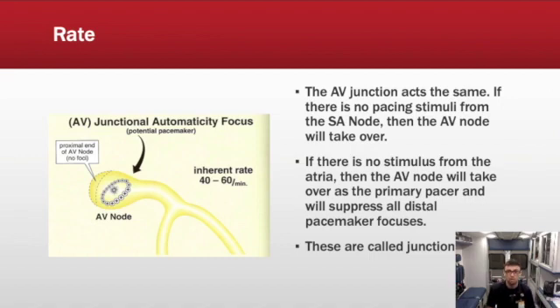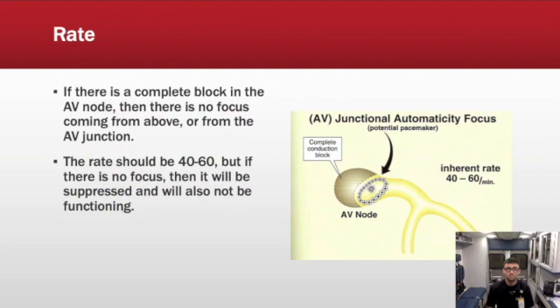These beats are called junctional beats, and just like we talked about earlier, you can think about the P wave, that short hump before the QRS complex. That is where your SA node is primarily seen. But if we have junctional beats, we're probably not going to be seeing a P wave in these rhythms.